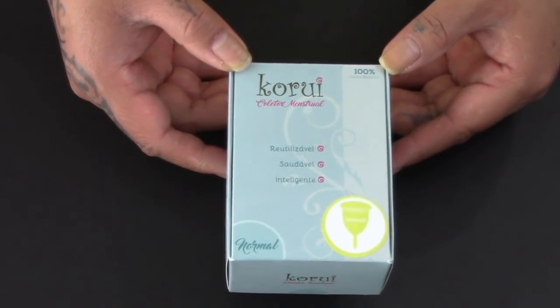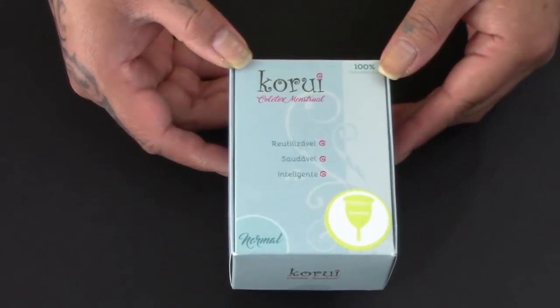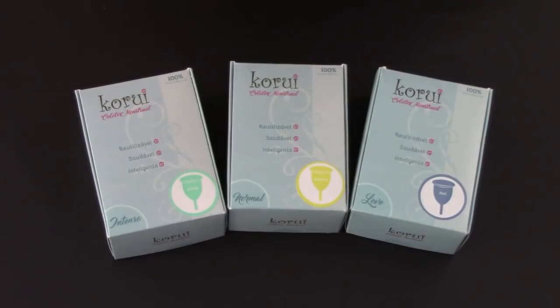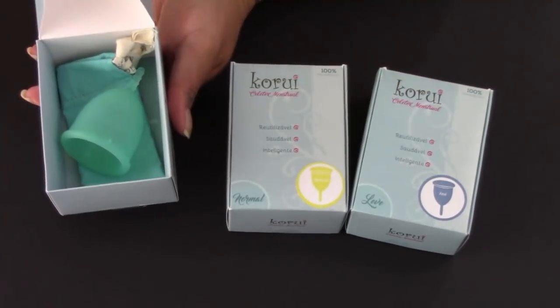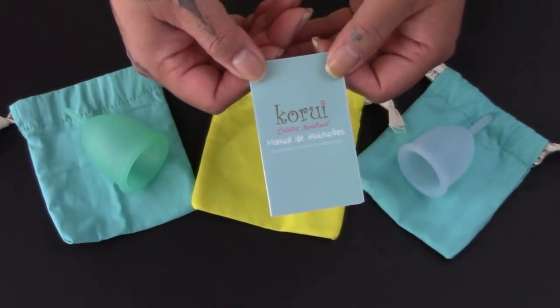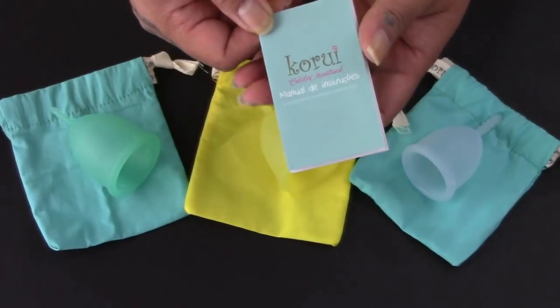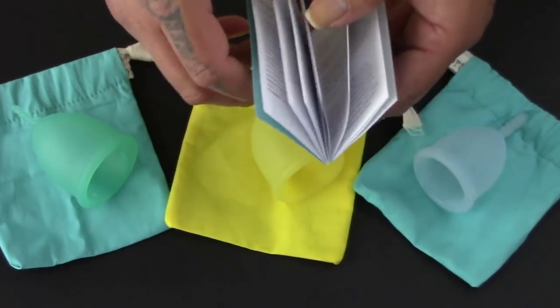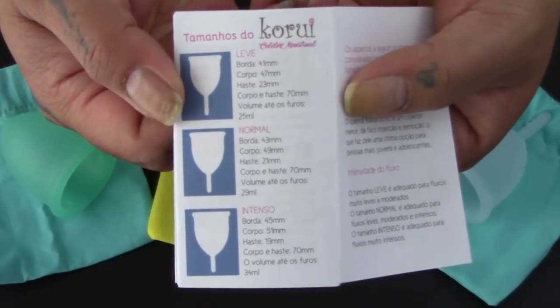First up, the Korui menstrual cup. I'll do a quick turnaround of the box — everything is the same besides the color and the size indicator. Here are the three different sizes of the Korui: the large, medium, and small. Here are the three different colors that I purchased. They do have some other colors and you can check that out on the website. Here is the pamphlet that these cups come with and it is all in Portuguese, so I'm not really going to open it. It is quite a long booklet and it is printed front and back. But here's some information that will probably interest you.